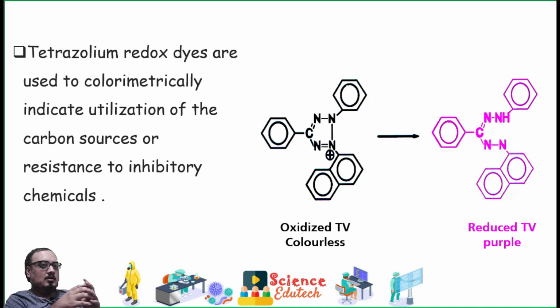Now, in these reactions the Biolog redox dye mixtures are used, in which tetrazolium redox dyes are used to colorimetrically indicate the utilization of carbon sources or resistance to inhibitory chemicals.